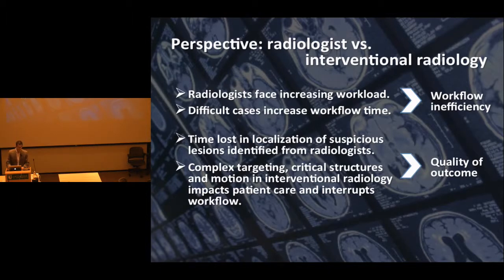Also, the interventional radiologist will try to handle complex targeting, so trying to reach some targets that are difficult to attain, and avoid some critical structures during the intervention. It can impact patient care and interrupt the workflow. So it may affect the quality of the outcome.